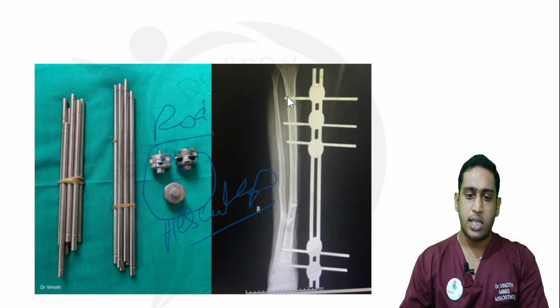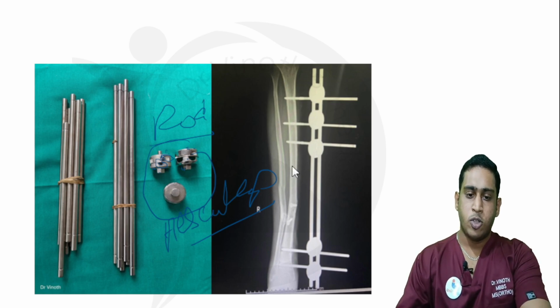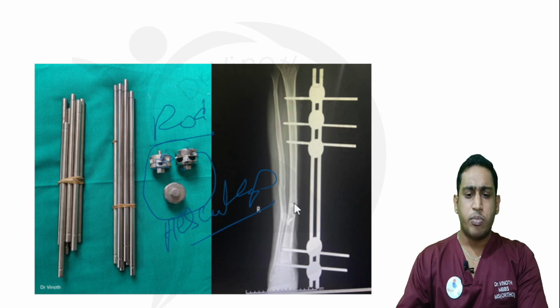So here, as you can see, the SCHANZ pin is inserted into the cortex of the tibia. Then the SCHANZ pin is connected to the rod with the help of the AESCULAP clamp. So here we have maintained the length and rotation. Minimally it is in varus. Yes, length, rotation and alignment are more important.